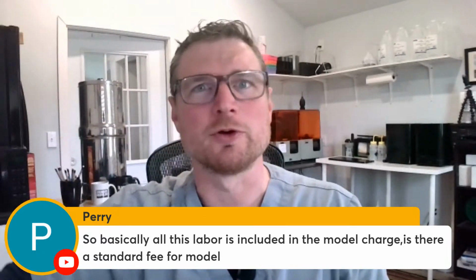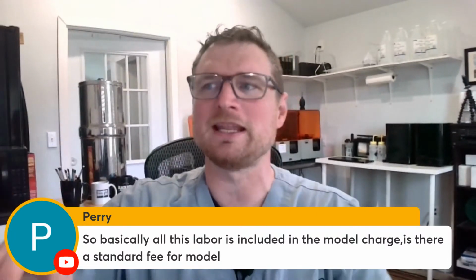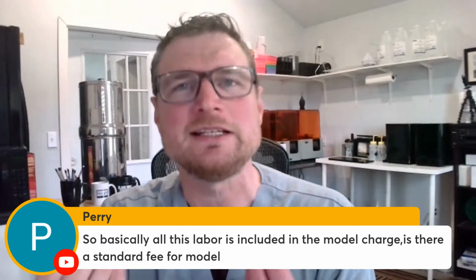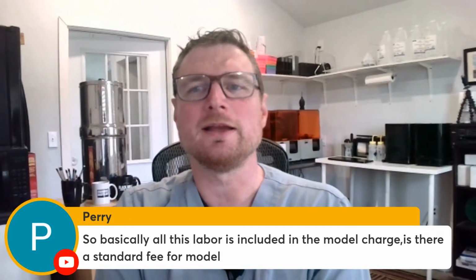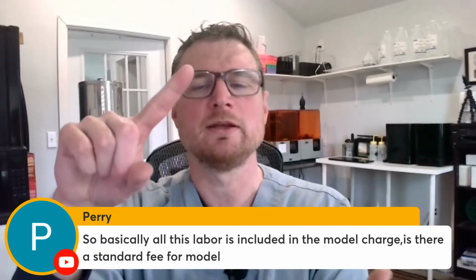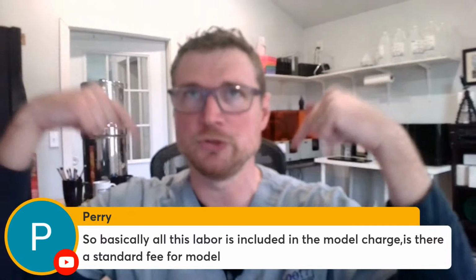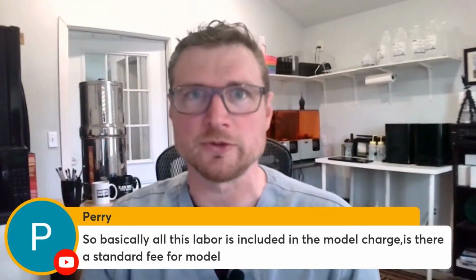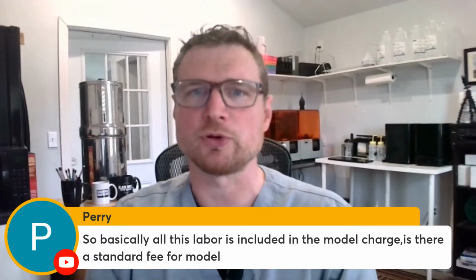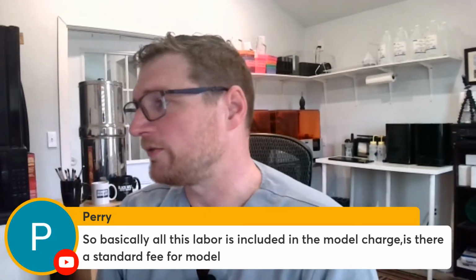Now I've charged more for that now, but that's pretty much the labor in a digital model: the software, the resin, the printer payment, and the user, if you pay someone to do this, to get it to print. So yeah, that's where the price of the models goes.